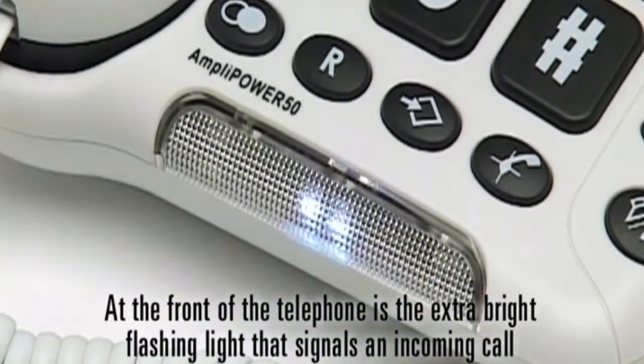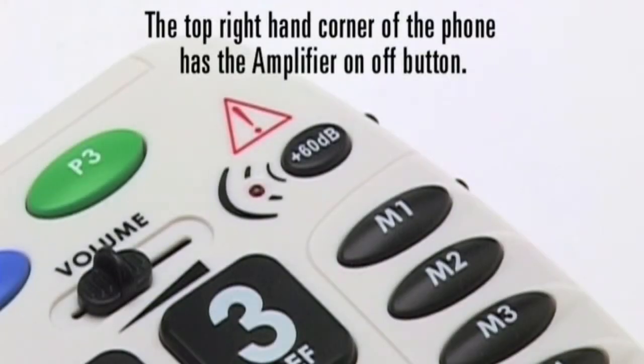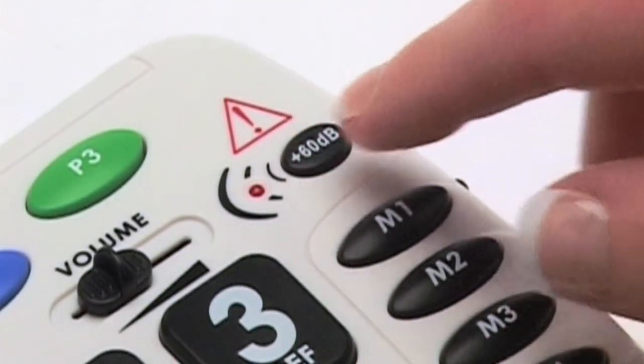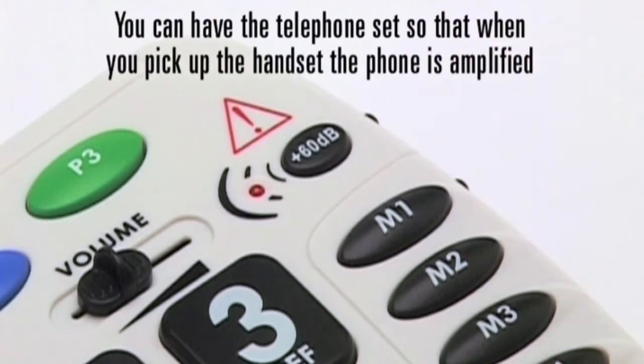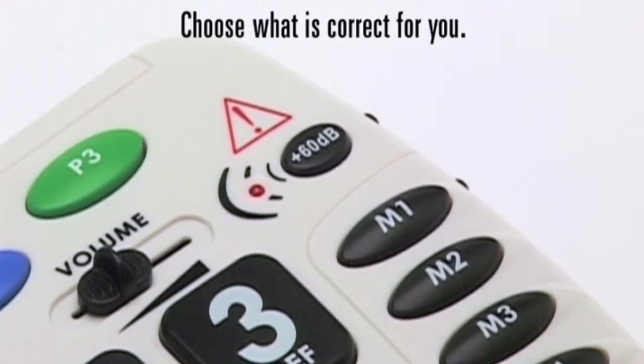At the front of the telephone is the extra bright flashing light that signals an incoming call. The top right-hand corner of the phone has the amplifier on-off button. You can have the telephone set so that when you pick up the handset the phone is amplified, or you can have it set at regular volume. Choose what is correct for you.